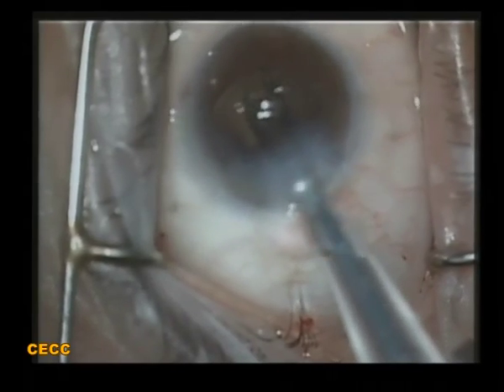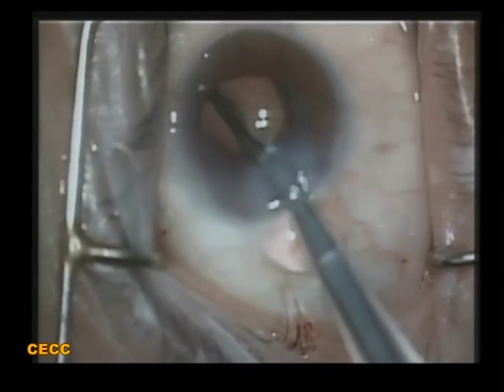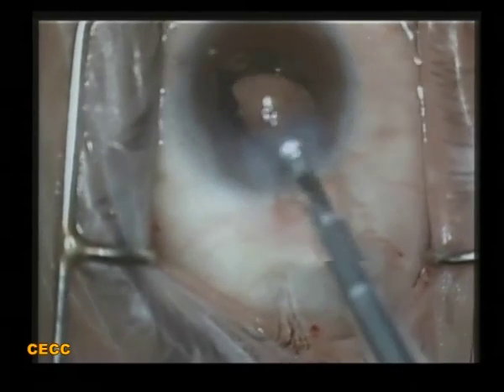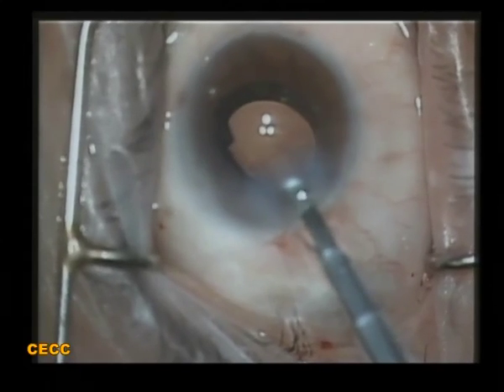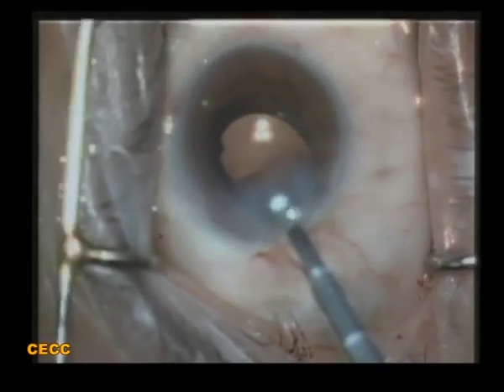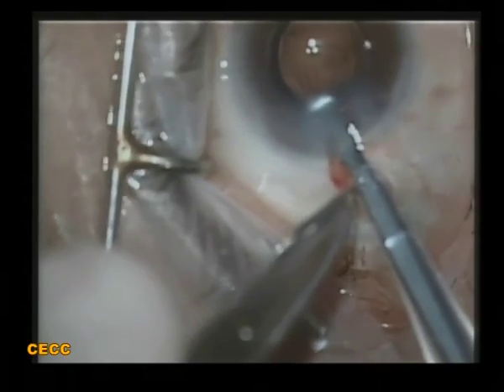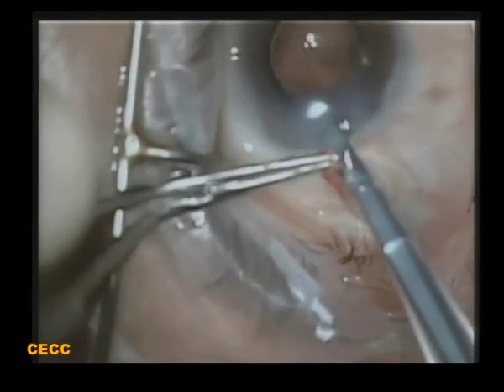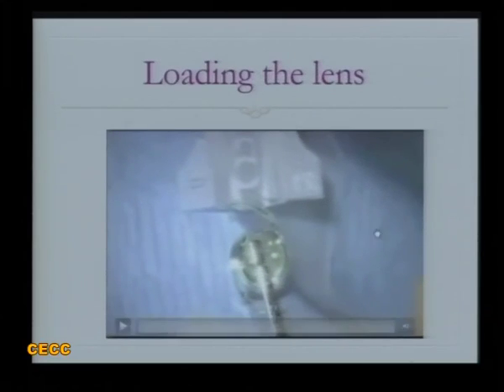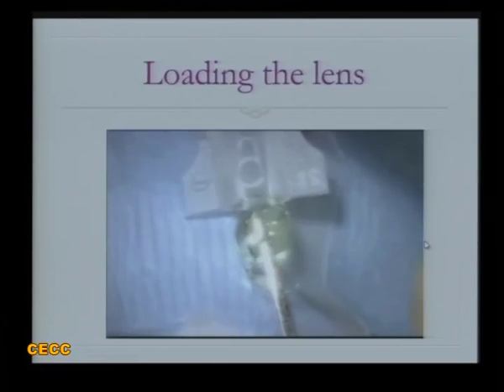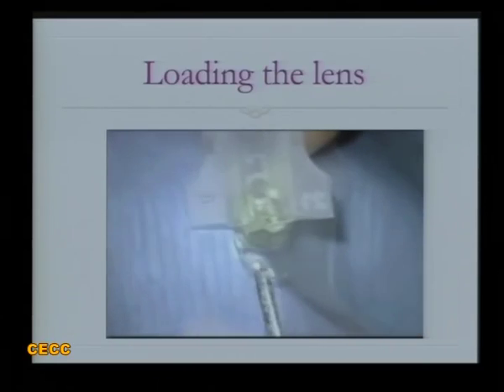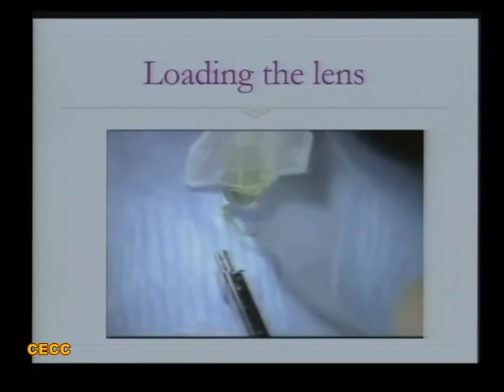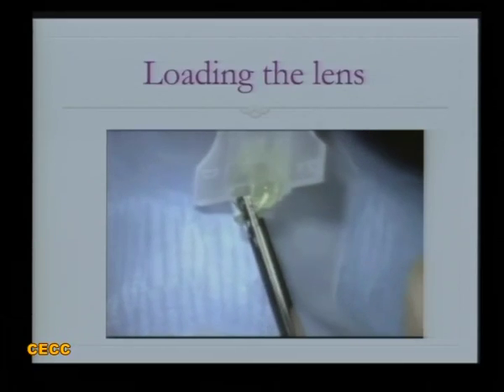In another hard brunescent white cataract, phacoemulsification was complete. Using a screw-mechanism injector, I didn't realize the back haptic had not been tucked properly over the IOL. The patient was under topical anesthesia and I couldn't withdraw or reposition it. The only option was to cut the cartridge to free the haptic rather than explant and reimplant the IOL. Luckily the patient was cooperative and the cartridge was cut successfully. The key point: when loading the lens, both haptics must be above the lens for proper insertion — otherwise the haptic can get stuck in the plunger.